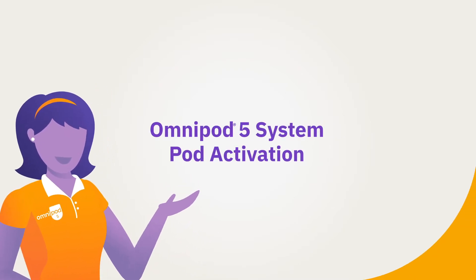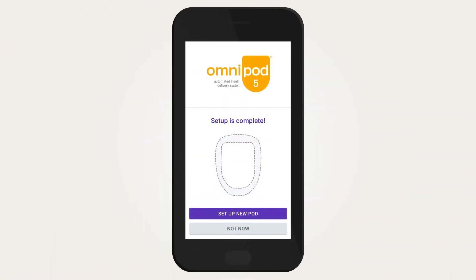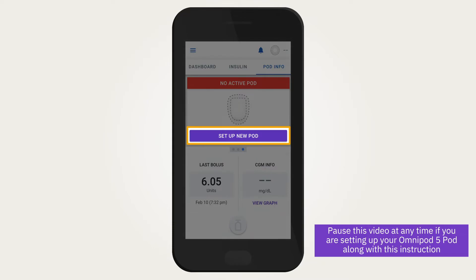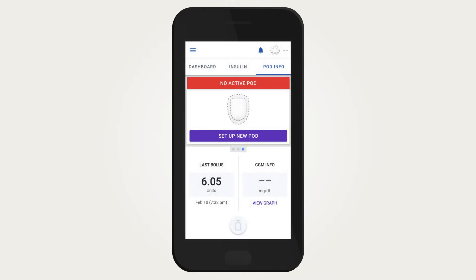Omnipod 5 system pod activation. After initial setup of the Omnipod 5 app, a prompt will display to activate a pod. If you are not ready, simply tap 'Not Now.' When you are ready, you can tap or swipe over to the Pod Info tab from the home screen. A pod should be changed every 72 hours or when the pod's insulin reservoir is low or empty.